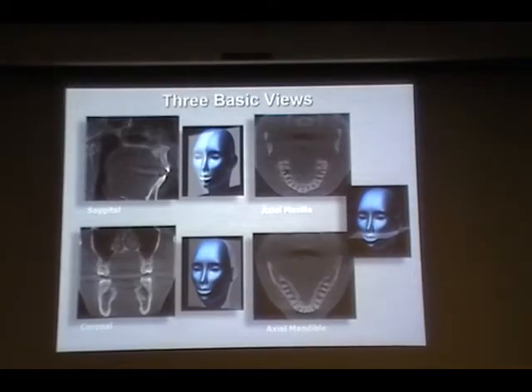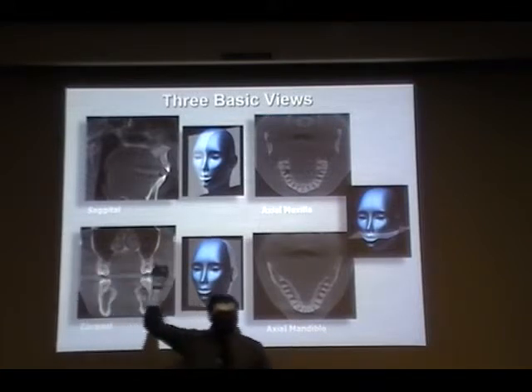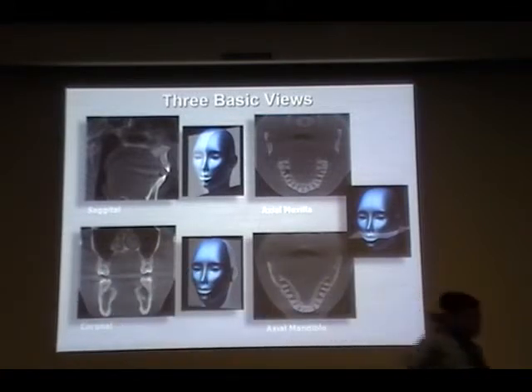Like here. So here you can see all the three dimensions. It looks like I always try to correct the sagittal. The spelling here is a mistake. It's double T, not double G. So I don't know why it reverts back to that.